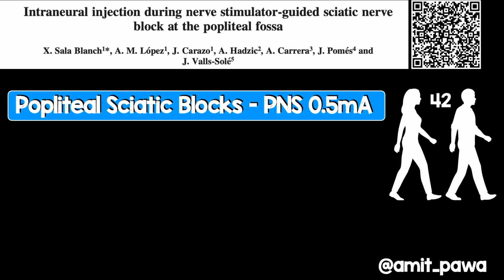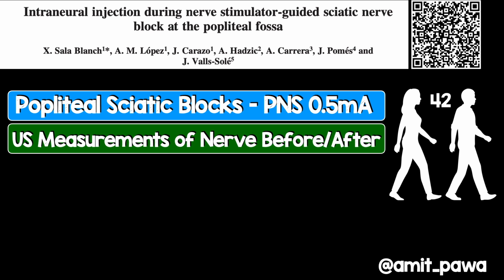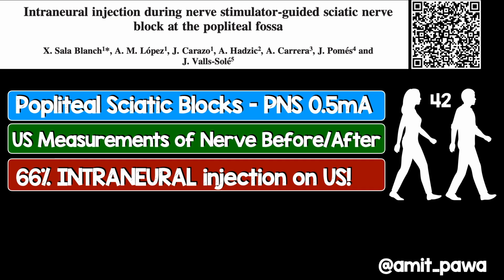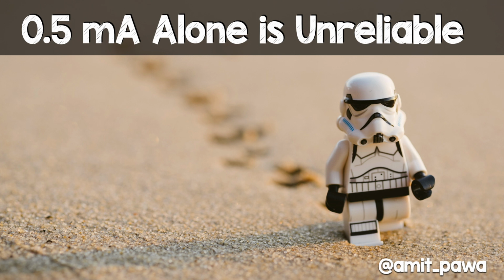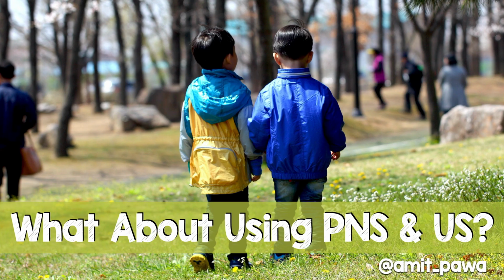How about this study? In this study, they performed their popliteal sciatic nerve blocks using a threshold current of 0.5 milliamps as their endpoint. They measured the cross-section of the nerve before and after injection, and what was fascinating was in 66% of cases when they used a threshold current of 0.5 milliamps as an endpoint, there was an intraneural injection. 66% of cases had intraneural injections using 0.5 milliamps. So clearly in these 42 patients, peripheral nerve stimulation did not prevent intraneural injection. So I think hopefully we've demonstrated that we can send peripheral nerve stimulation alone packing, as 0.5 milliamps alone is unreliable.